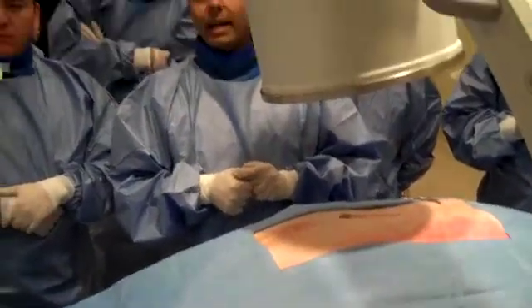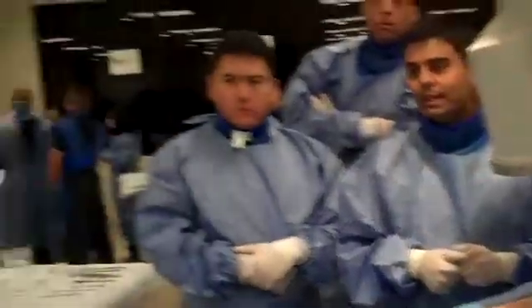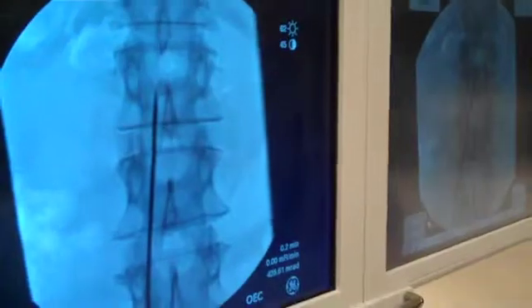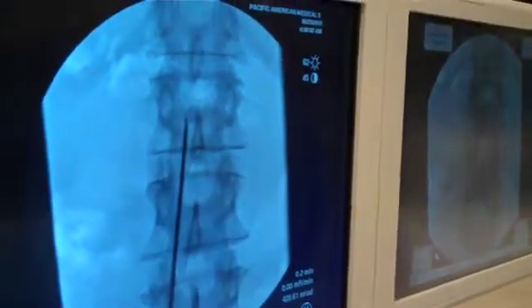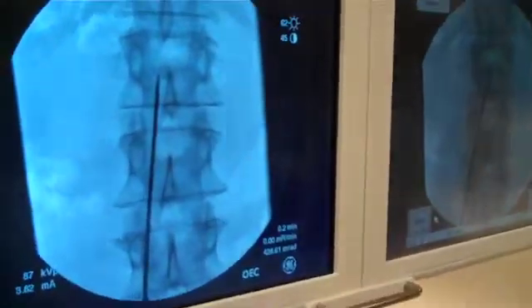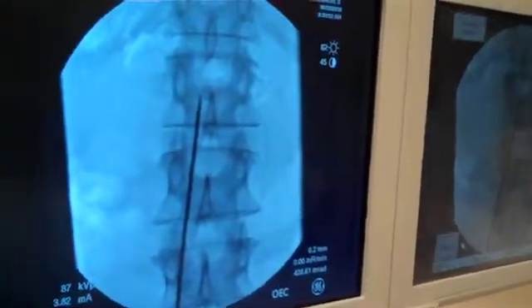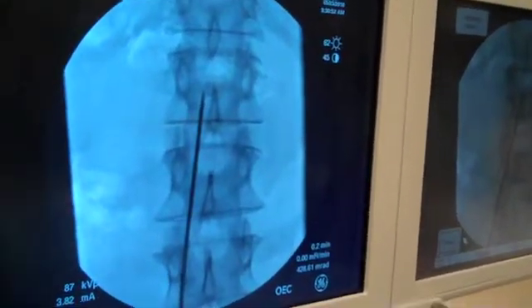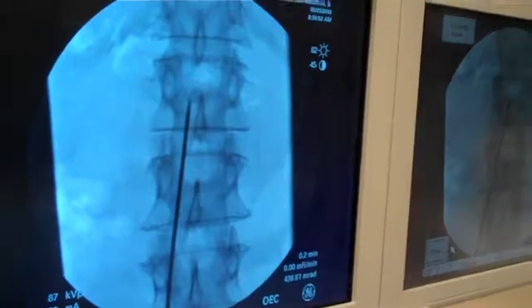This is a bad angle also, in that even though we enter in, it's a lot more likely to go up over there towards the left side of the gutter than what we want. And in comparison over there to the right side of the picture.